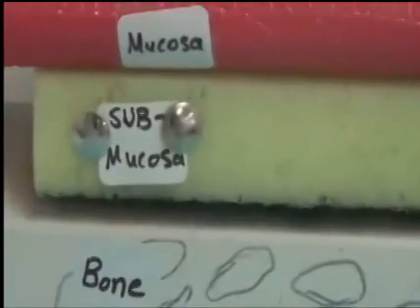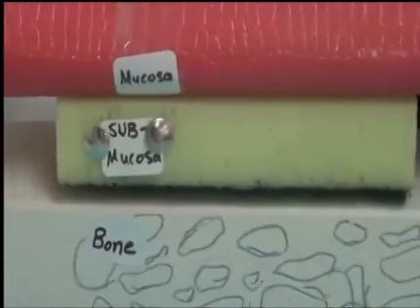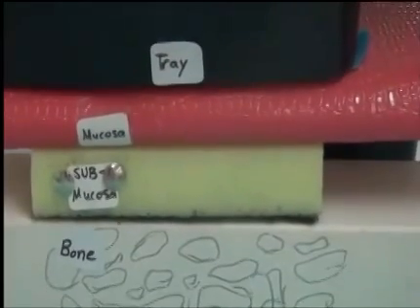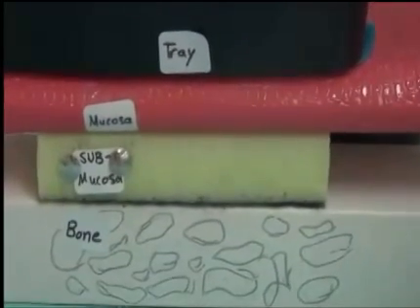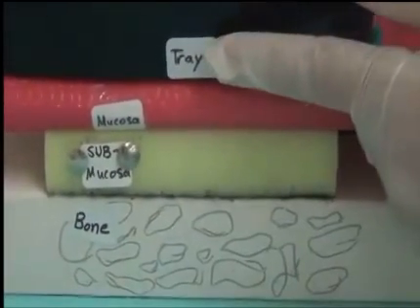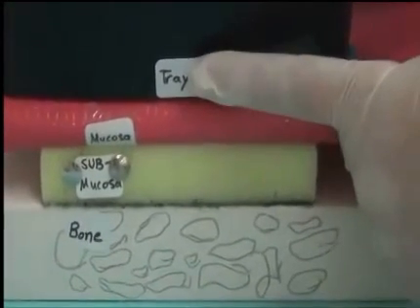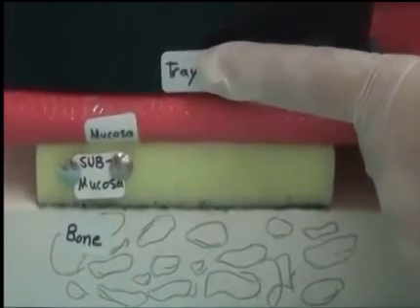If I bring a tray and place it over this mucosa and tissue and press without any spacer, that means the tissue will be recorded at this stage, which is the compressed stage.